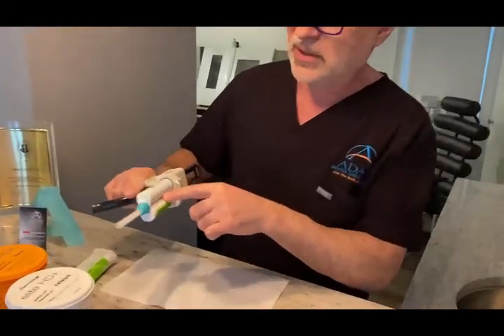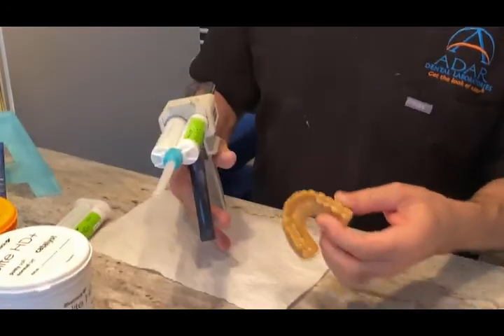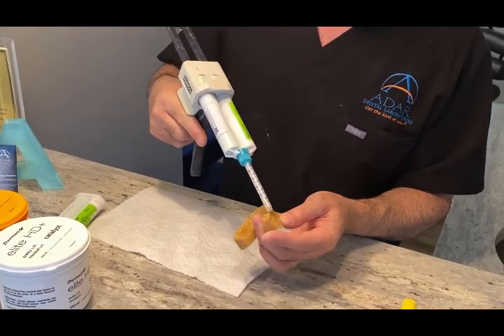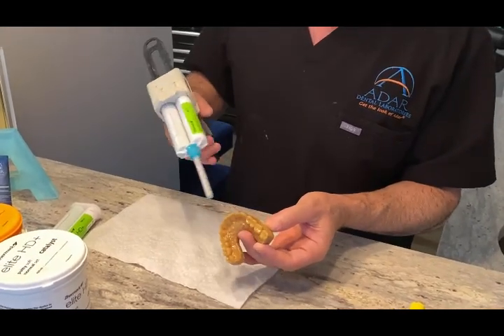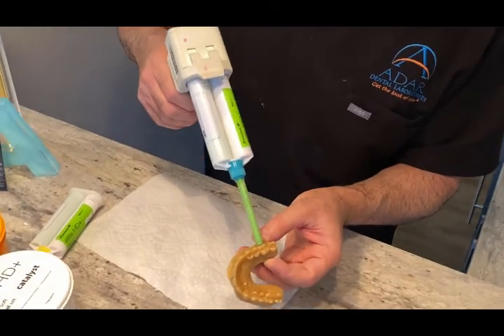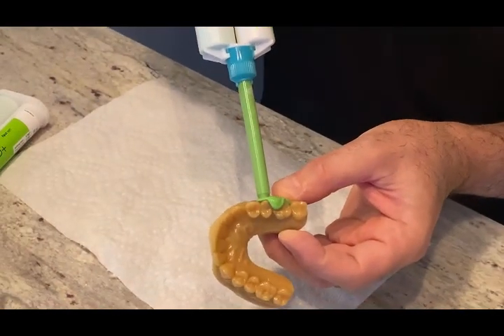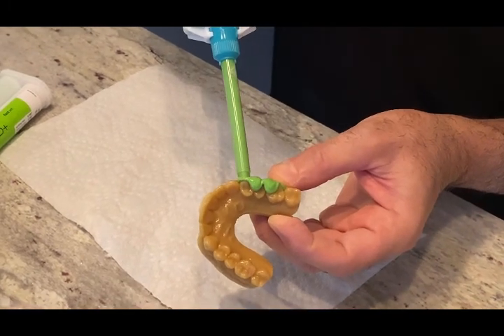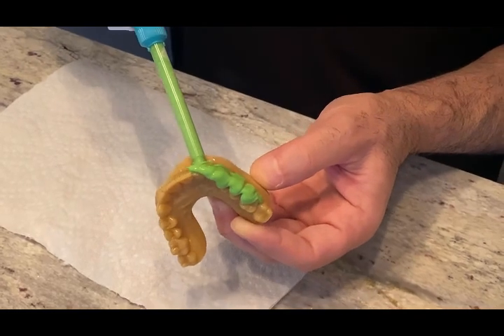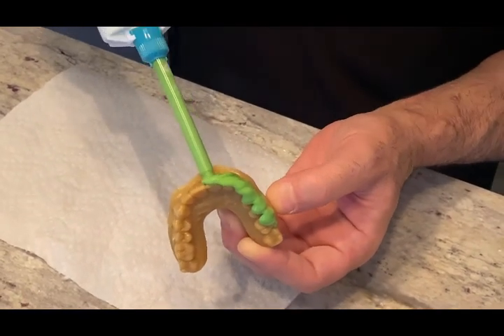Make sure you have enough material for this. This one was a 10-unit wax-up, so I do a little bit extra so I have more to cut. I take that big opening and squirt — just like that. All the details are in. Make sure that you go beyond the sulcus, the margin.